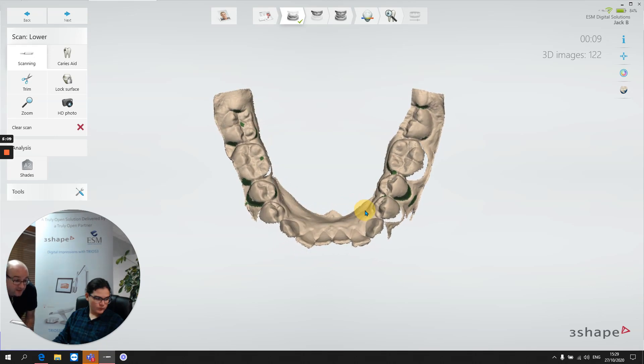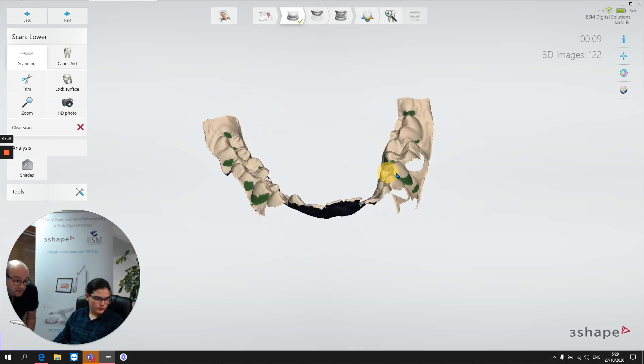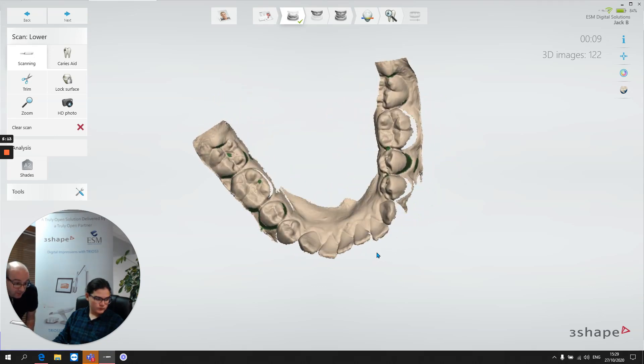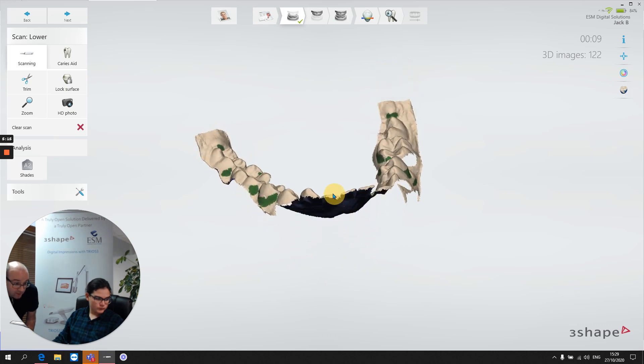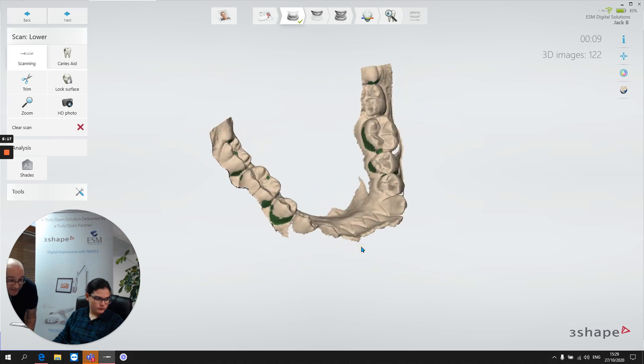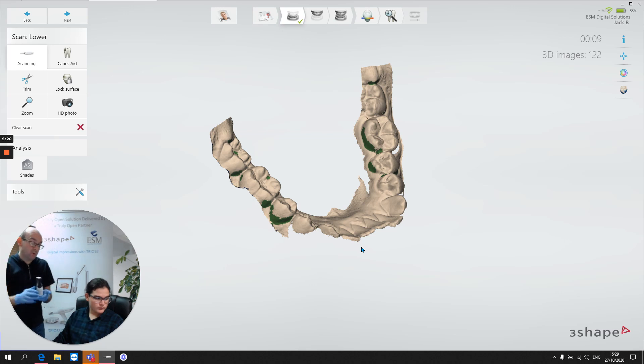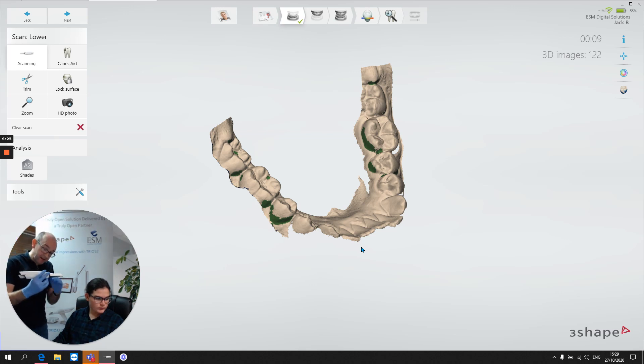However, on the incisors, you can see we're missing quite a bit of detail and really from three to three, we're missing all of the buccal detail there on those teeth. And that'd be quite typical. The reason being because the teeth are flared out and it would be a tendency for us to hold the scanner.